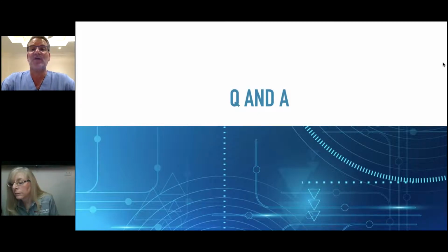Yes, so that's a great question. If you've got good tug back, and after doing thousands of cases, my rate of extrusion is very, very low. Listen, sometimes we do. Sometimes we miscalculate where our tug back is, and we end up getting tug back higher up than the apical 1/3, and when we downpack, we end up extruding it past. But very low. I can count on one hand the amount of extrusion of actual gutta percha cone I've had in the last couple years. Now, I do get some sealer coming out the apex or lateral canals. We do get what we call the shoulder puff, or the puff of sealer, which I don't mind. But actual gutta percha cones coming out, very, very low incidence, as long as you have a well-fit cone.